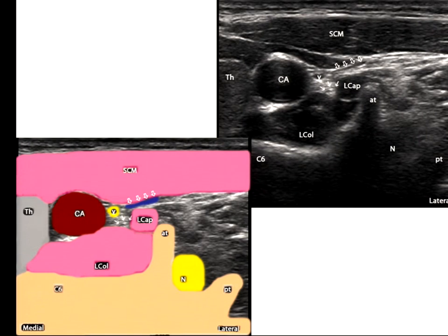Stellate ganglion block is in the thorax, in front of the neck of the T1 rib. So we're counting that if we inject it in the correct fascial plane, the medication will go up and down along the longus colli muscle, as far down as T3 and T4 even, if you're in the correct fascial plane. And this is an advantage of ultrasound. So this is what I'm saying, that we need to be very specific.